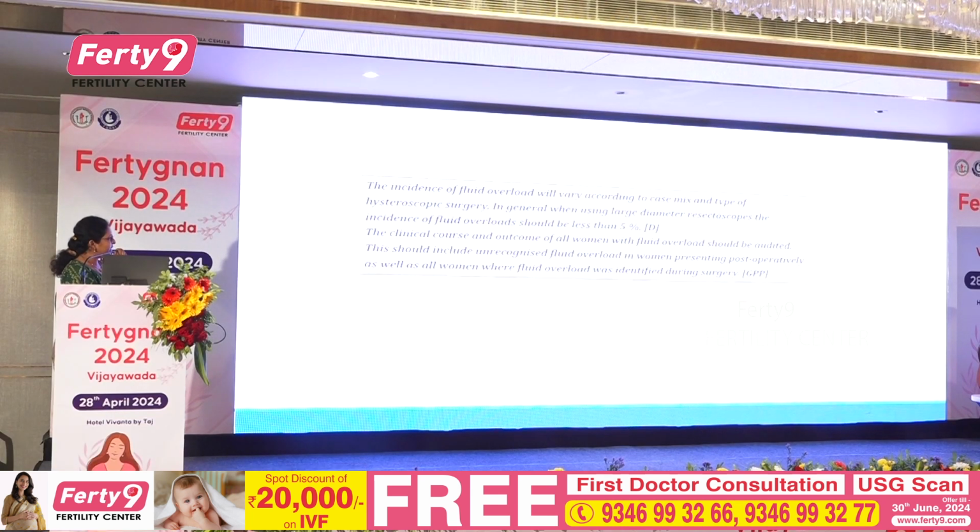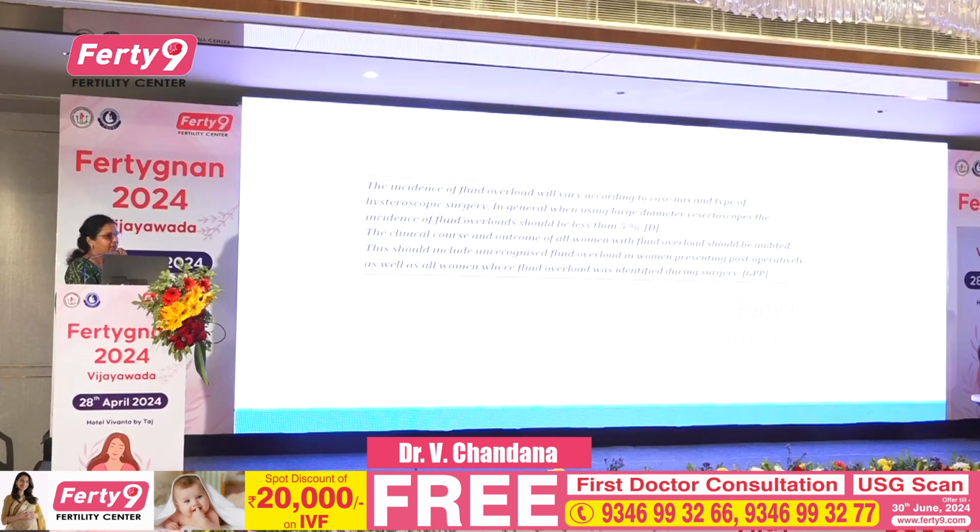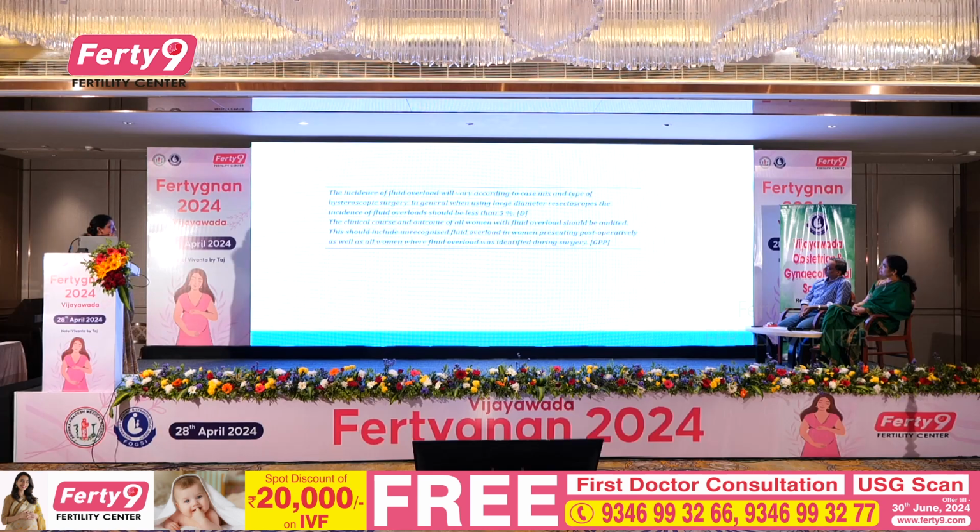The incidence of fluid overload will vary according to the case mix and type of hysteroscopic surgery. In general, when using large diameter resectoscopes, the incidence of fluid overload should be less than 5%. So don't be afraid of fluid overload before starting to learn hysteroscopy or doing a level 1 surgery, because it's not very common. The clinical course and outcome of all women with fluid overload should be audited, of course. This should include the unrecognized fluid overload which your anesthetist has been pumping.